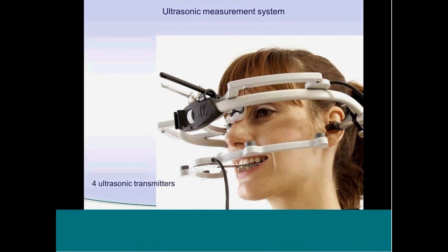Here we have 4 ultrasonic transmitters at the lower bow in these 4 different positions. In the upper bow, we will find 8 microphones located here, on the left side 4 and on the right side the other 4. And then from the ultrasonic transmitters very short ultrasonic bursts will be sent. And from these bursts we can measure the traveling time from the transmitter to the microphone.